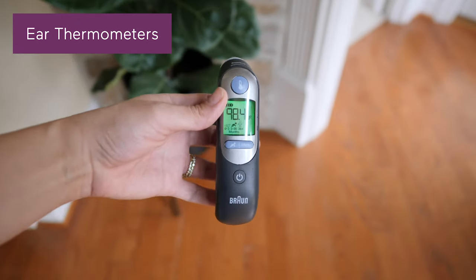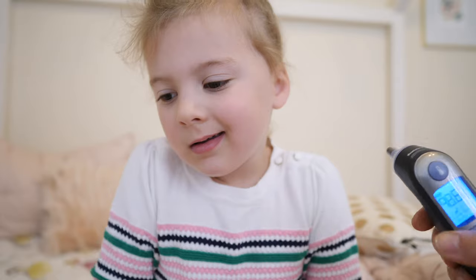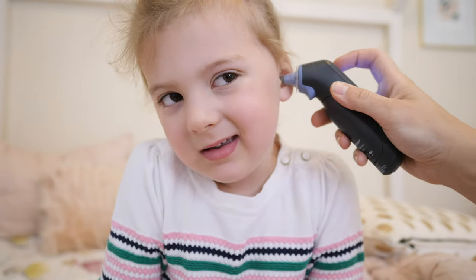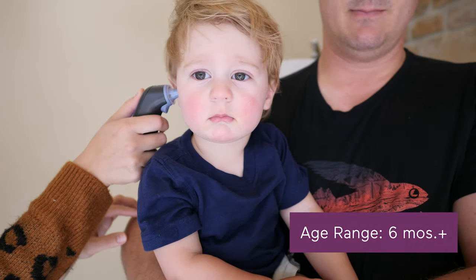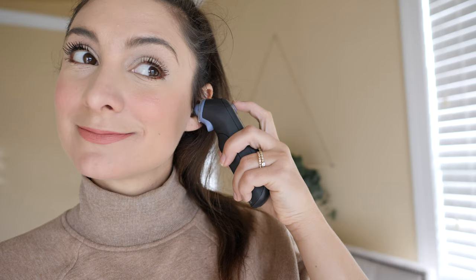Next up, ear thermometers, also known as tympanic thermometers. They use infrared rays to measure the temperature inside the ear canal. You can start using these on your baby when they reach six months old. They are super quick and generally comfortable for both children and adults. Be aware that if your baby is suffering from an ear infection, getting a read using their ear could be difficult and uncomfortable.